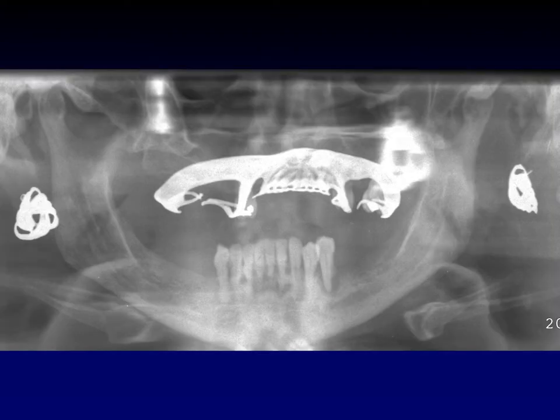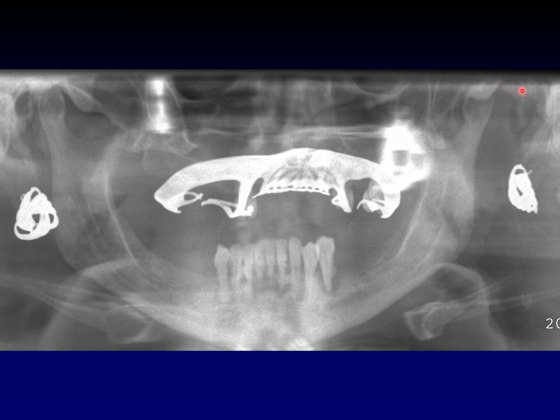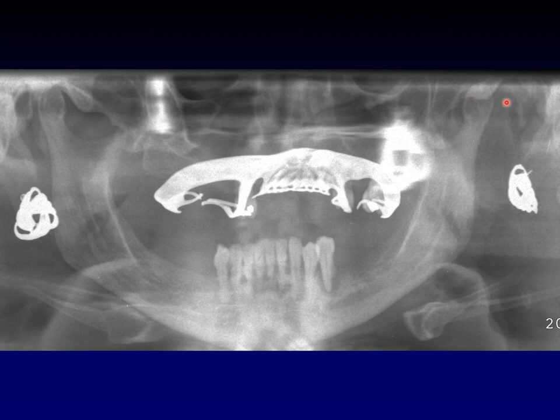This is an example of a temporomandibular joint dislocation. On the normal side, you can see the condylar head seated nicely in the glenoid fossa — that's the normal relationship. However, on the affected side, the condylar head is out of the glenoid fossa and instead is projecting over the articular eminence that is anterior to the glenoid fossa. That's a complete dislocation. Sometimes the joint will simply sublux a little bit and not come all the way out, but this is what a temporomandibular dislocation looks like — the condyle out of the glenoid fossa.